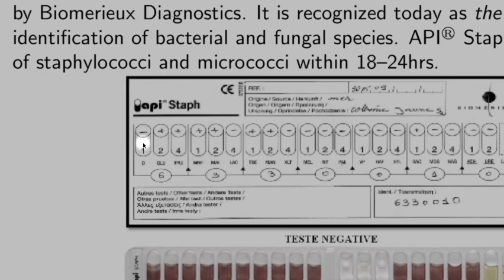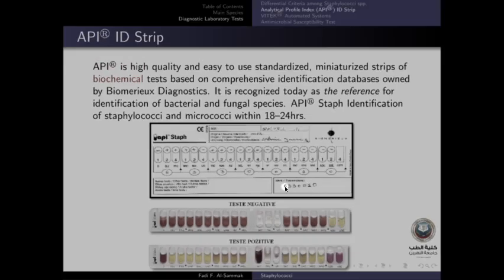If we have negative results, the result that is negative won't be counted, but when the result is positive, it will be added. So in this first compartment, we add the 2 because it is positive, and 4. So 2 plus 4, we have 6. And 1 won't be counted because it is negative. And this 6 is the first digit of this number.